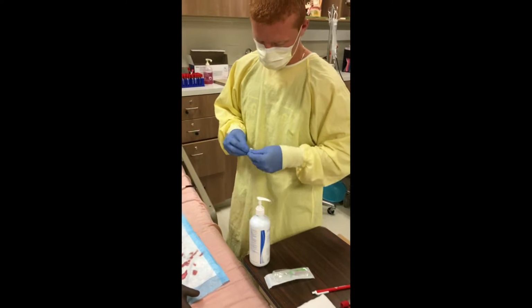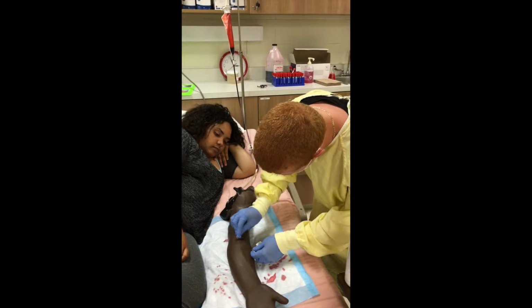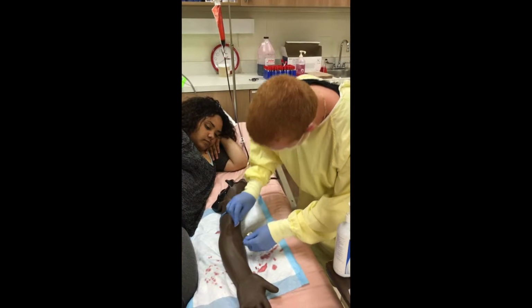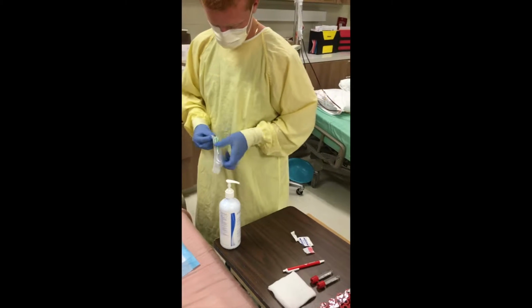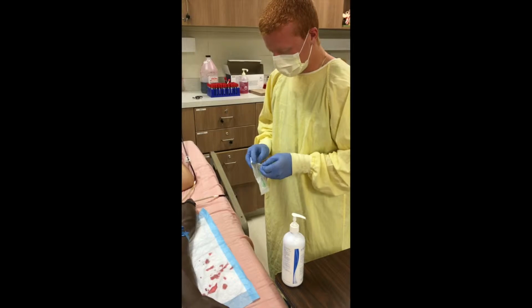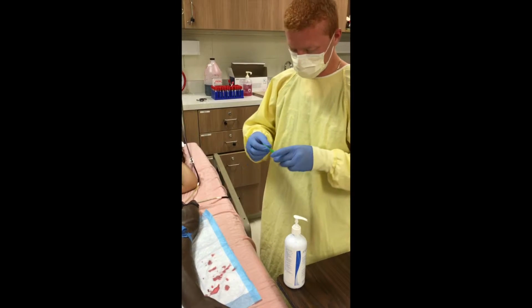Then take the alcohol swab and swab the area in small circles. They gradually get bigger. Give it a few moments to dry. And you're going to open up the Vacutainer and dispose of the garbage. You want to be careful.